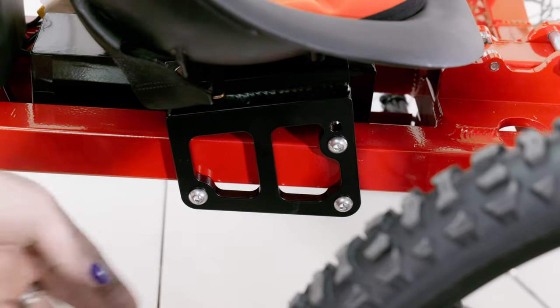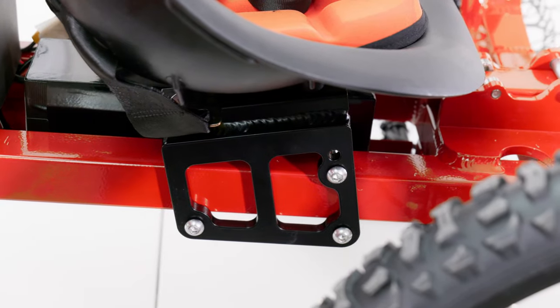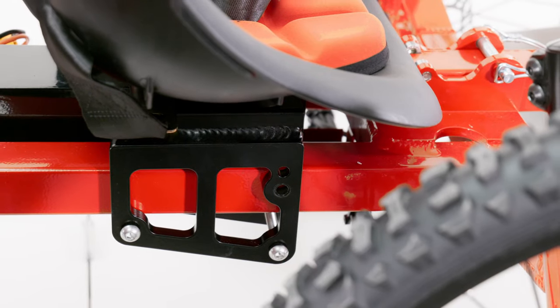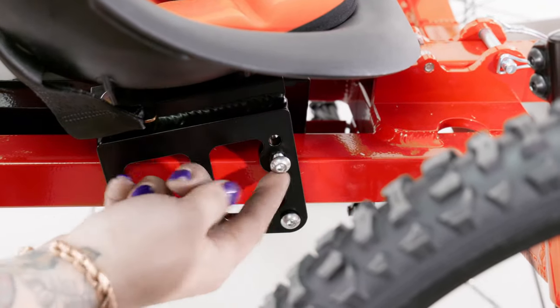The next adjustment will be the seat. There are three 5mm Allen bolts on each of the bottom seat brackets that when loosened will allow you to slide the seat back and forth to adjust for the height of your rider. You can also move the top bolts of each of the brackets to their lower positions to lean the seat back for more comfort.